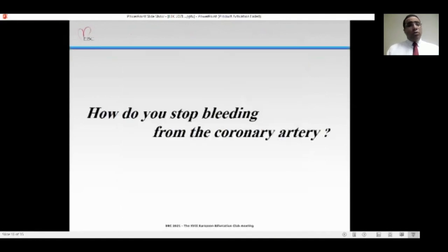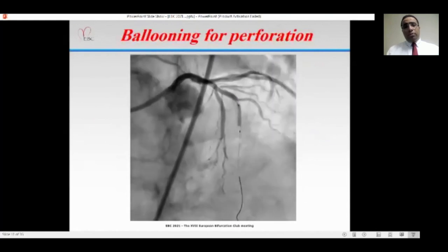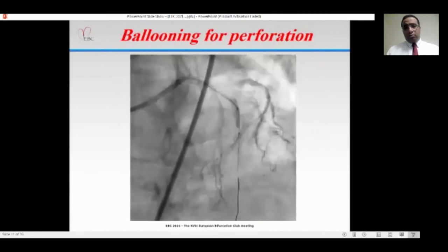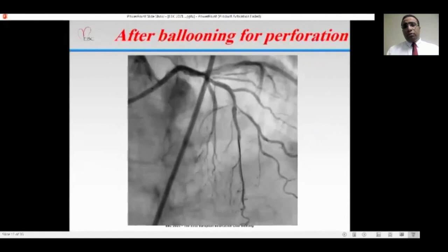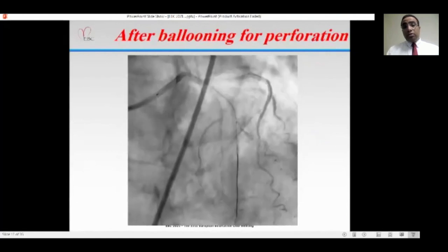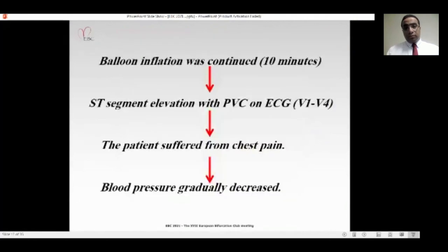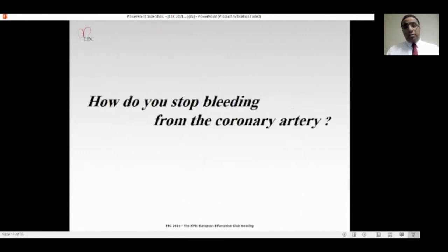So how do you stop bleeding from the coronary artery? I started with the regular method, using ballooning for the perforation for 10 minutes. After ballooning, the perforation was still present. Balloon inflation was continued for 10 minutes, with ST-segment elevation and VPCs on the ECG. The patient suffered from chest pain and the blood pressure gradually decreased. This was a very stressful condition.